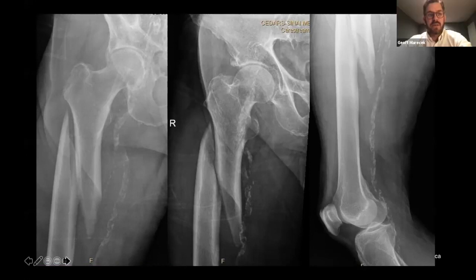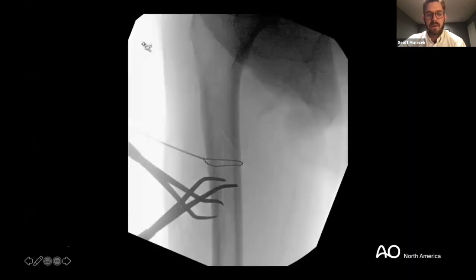Yeah, so to me, a similar thought process, right? This is a 90-something-year-old. He's got reasonable cortices, but this is a long, simple fracture. And so like we've all talked about already, I think an open reduction will save you lots of time and help you get this right. In addition, you can see, again, just like Dr. Westrick, I put on a couple clamps and reduced this.